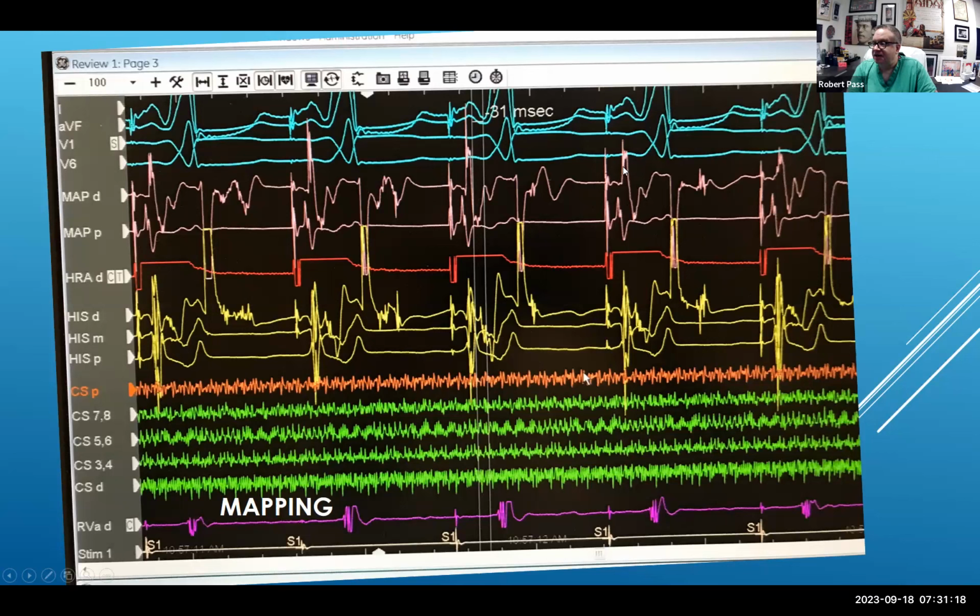You could make the argument that this essentially looks like one signal, but this is in fact an A and AV that are on top of the pathway and are so close to the pathway that there is in fact no isoelectric period between the atrium and the ventricle. Where the A ends and the V starts is challenging to know, but as you can see from this measurement, Josie measured it from here to, she's saying that the onset of the atrial electrogram is back here, at least 31 milliseconds before the onset of the QRS.